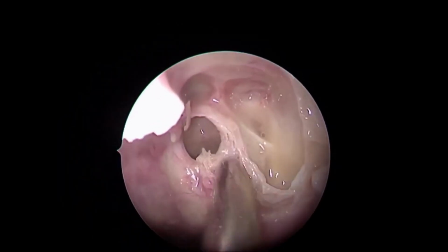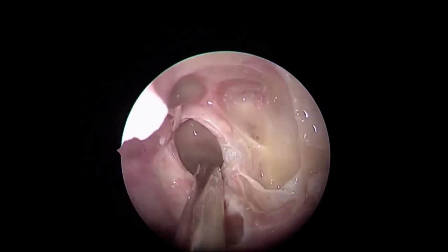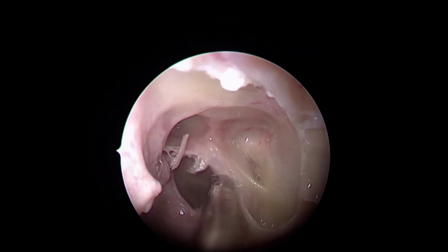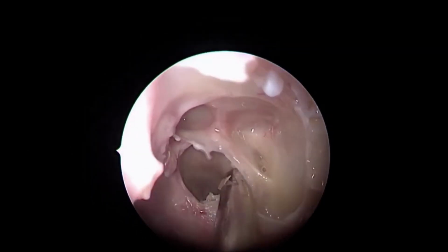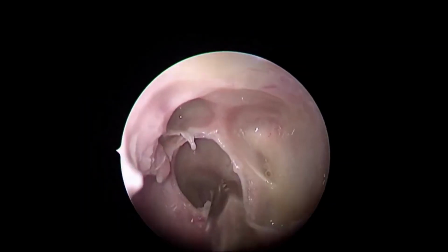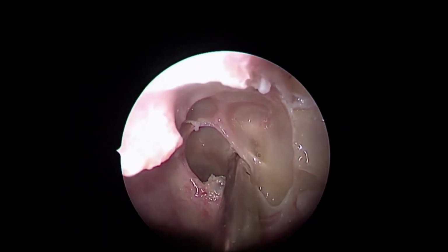Now, having seen this, what I am doing is enlarging this sphenoid sinus ostium under vision, staying close to the anterior wall, not doing any sharp instrumentation inside, just enlarging the anterior wall to see the interior of the sphenoid.